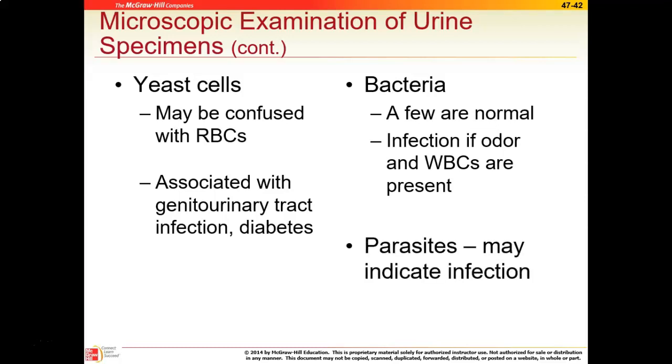There is a parasite that can actually be checked for in the urine called trichomonas. And trichomonas is actually a sexually transmitted infection. You can't really culture it for the most part. You can look at it underneath the microscope, and because it has a tail and is motile or mobile, it can find its way into the urinary tract, and you can actually detect it in the urine of some individuals as well.